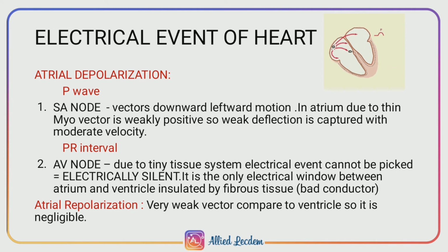Atrial repolarization. This provides very weak deflection compared to the ventricle, so this is negligible in the P wave.